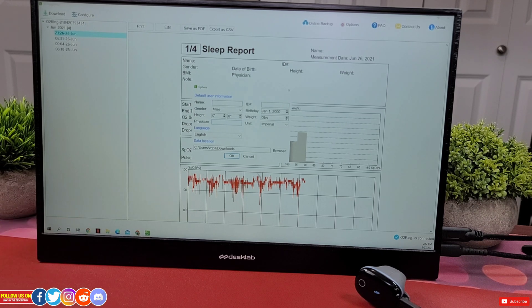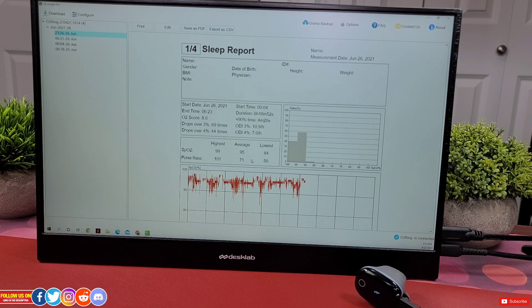If you have their premium subscription, you can download the data from the cloud by entering your login credentials from here.